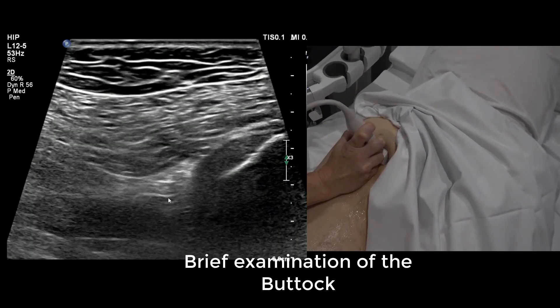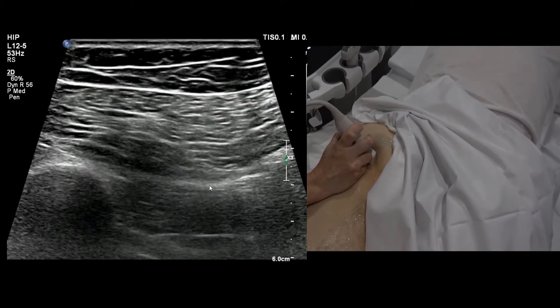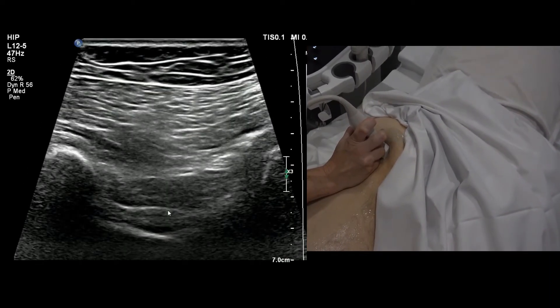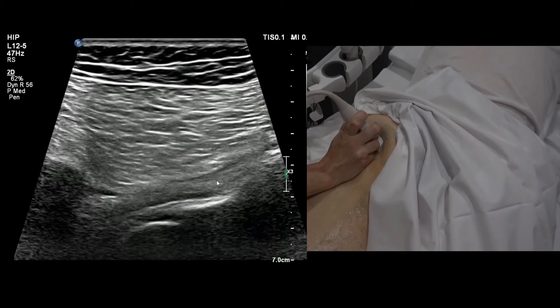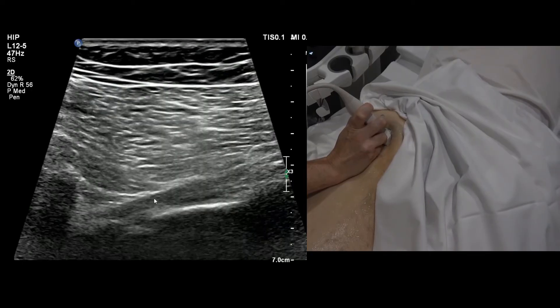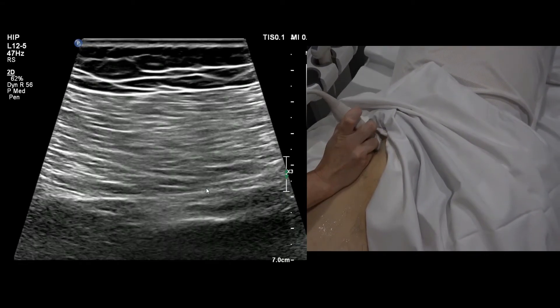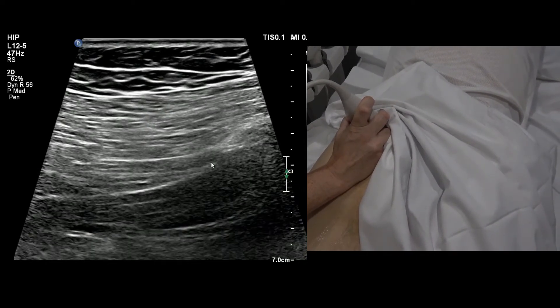Sciatic nerve here, quadratus femoris there — slide over and you hit the greater trochanter. Going above quadratus femoris, you'll see three little muscles in a row: inferior gemelli (hypoechoic), then an echogenic stripe which is obturator internus, then back to dark for superior gemelli. Above that, the sciatic nerve is diving deep. Any muscle above that, in towards the sacrum close to the sacral surface, is piriformis — visible as a triangular muscle.